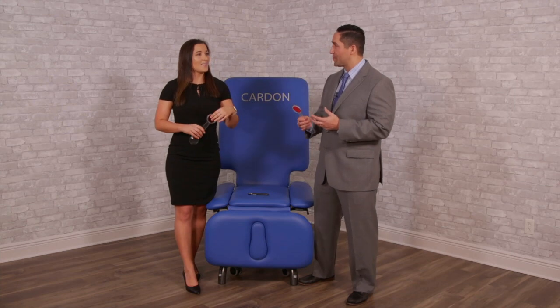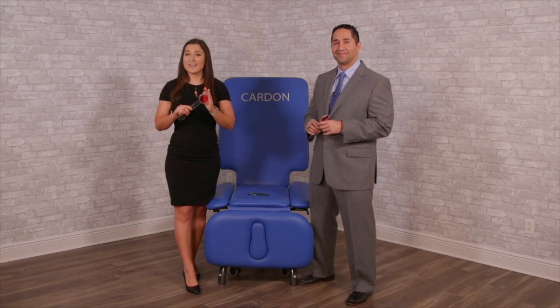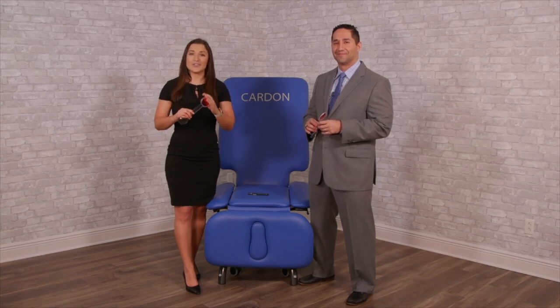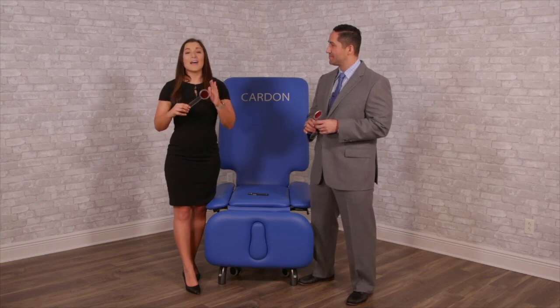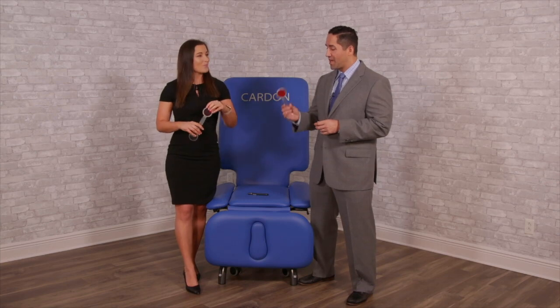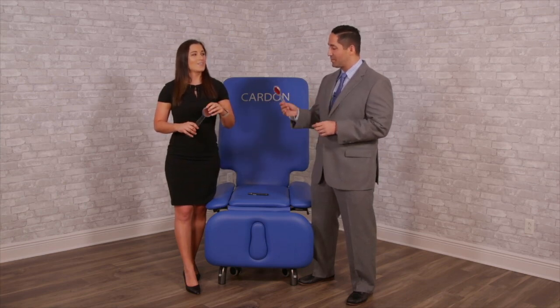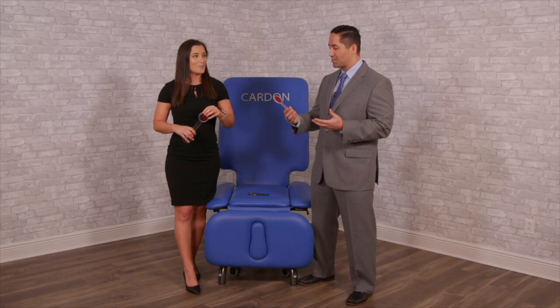The only information you get from the Maddox rod is eye position — the ability of both eyes to fixate on the same object. Traditionally it was only used to decide what kind of prisms to use in the ophthalmology clinic. Now we use it functionally as a way to assess how the cortical and subcortical regions are functioning, as well as the eye muscle integrity that controls ocular movements. Paired with a good physical neurological examination, it gives insight into how well the nervous system is functioning.